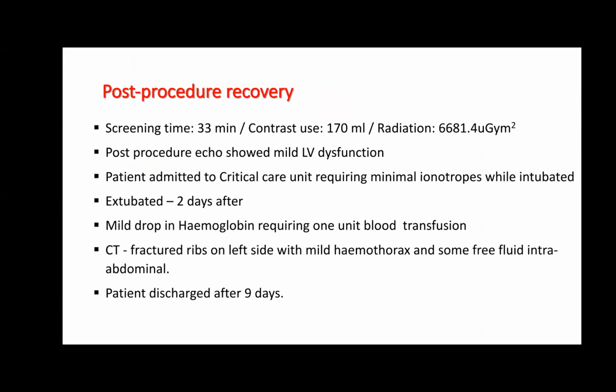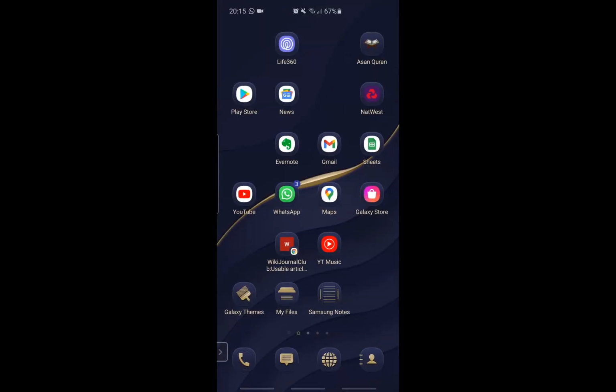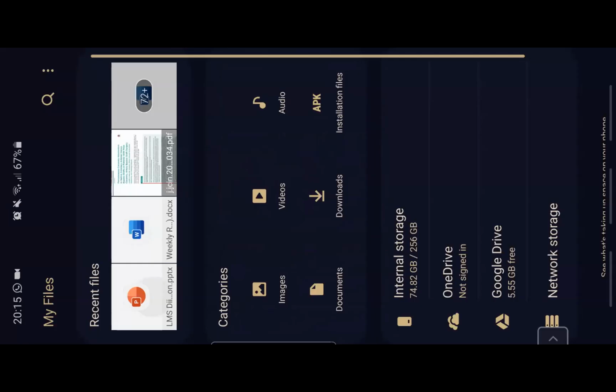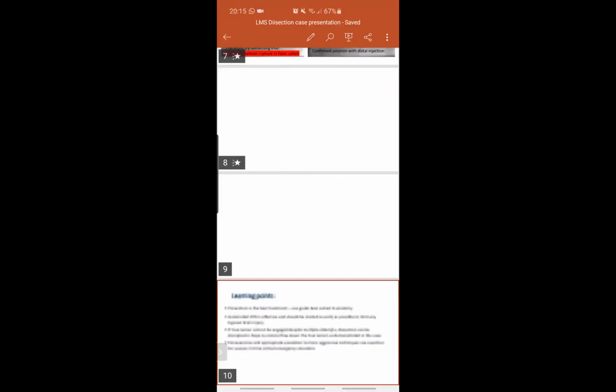So when they were coming proximally, they were molding the torn endothelium to the wall. And when they came to the left main, because the wire was distally in the lumen, they kept following it back with the stents, and that's how the circumflex got spared, I think.